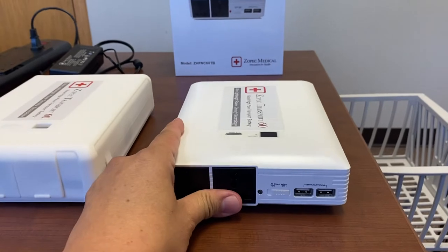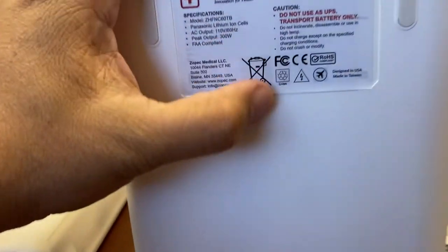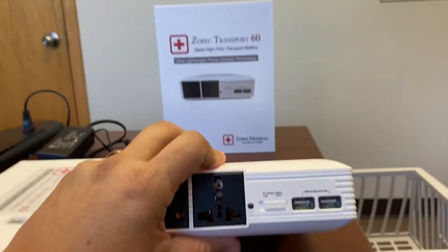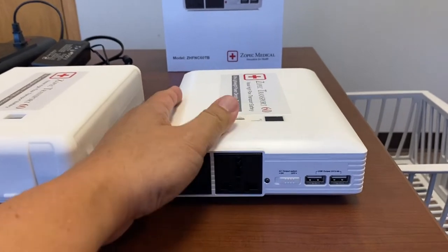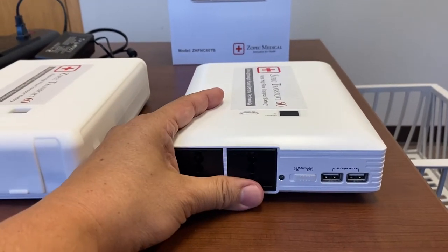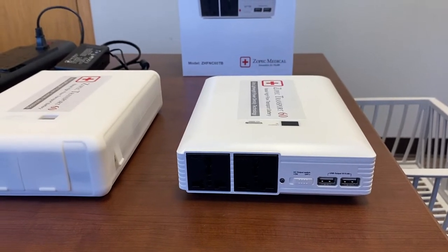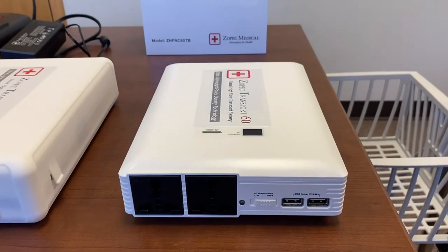It is FAA compliant — in the back you can see there's an air flight symbol. It has the maximum available capacity that's still FAA compliant, and you can get a statement from ZOPEC Medical if you like for air transport.